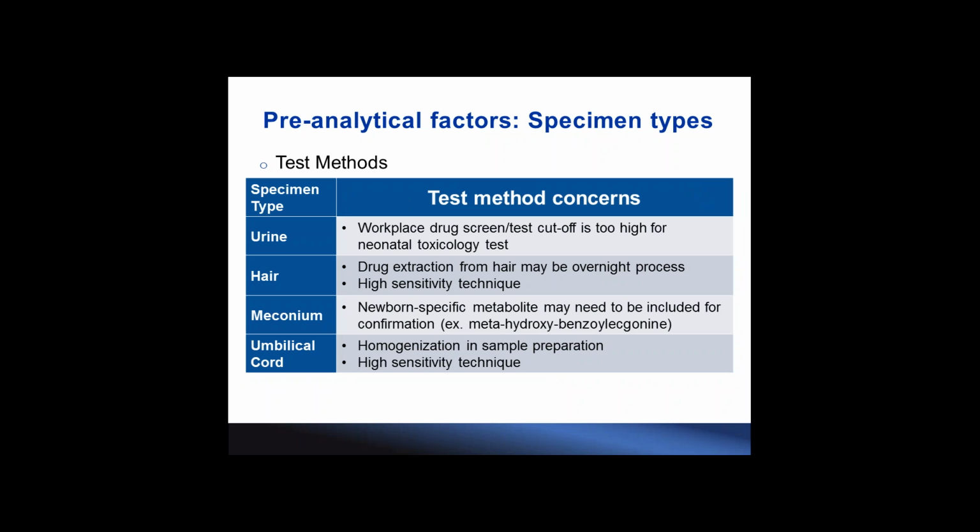The last factors we need to consider, and this is also an approach for professionals to evaluate the test methods to choose for neonatal drug testing. For urine, we need to be careful if you're asking your clinical laboratory whether they can perform urine drug testing.